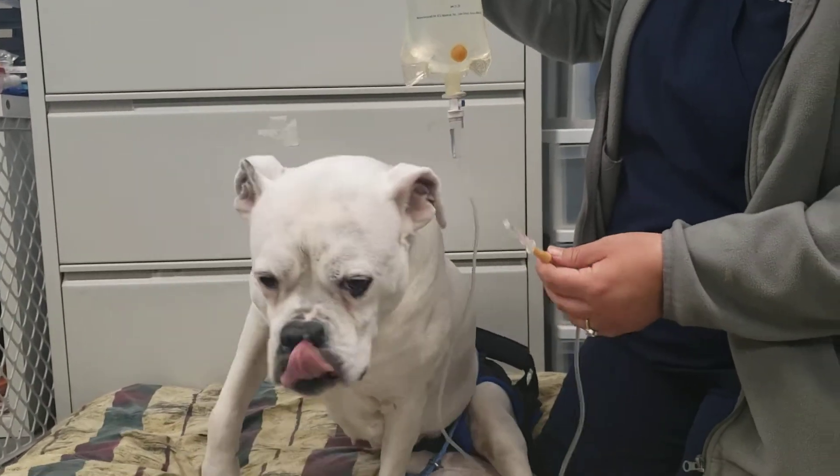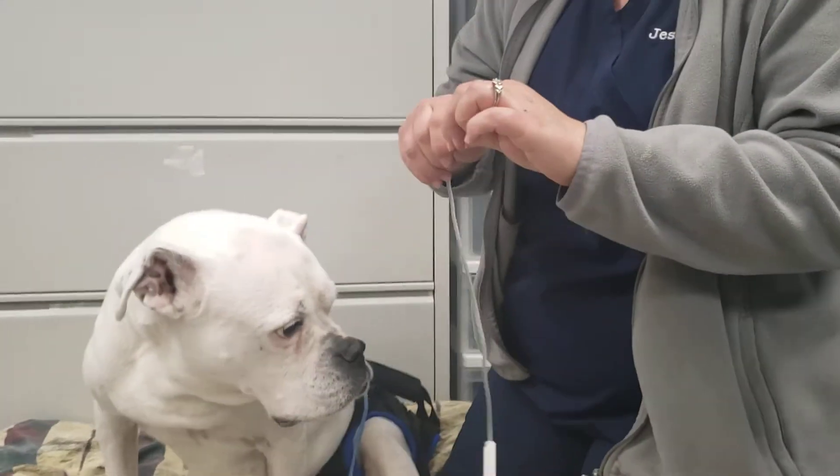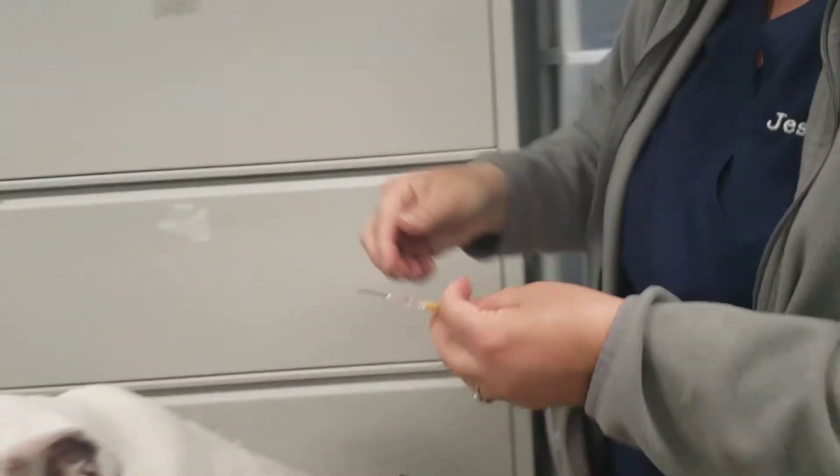Okay, now that we have our line set up, we are going to take our needle and take the cap off. Make sure you always put that in a place where you know where it's at so you don't lose it, because it is clear and kind of hard to find.